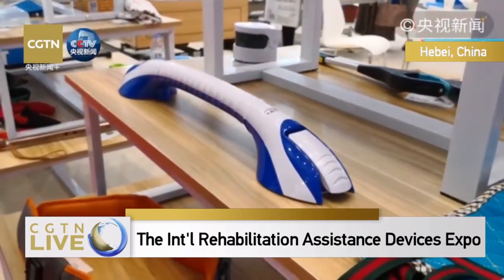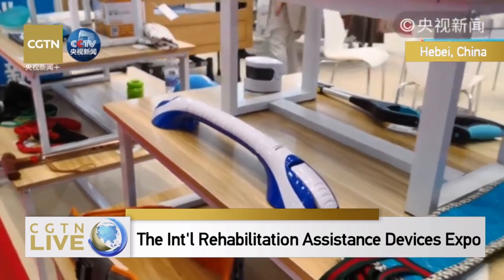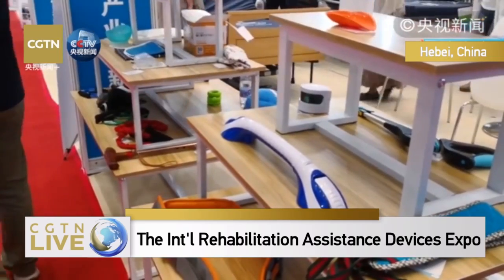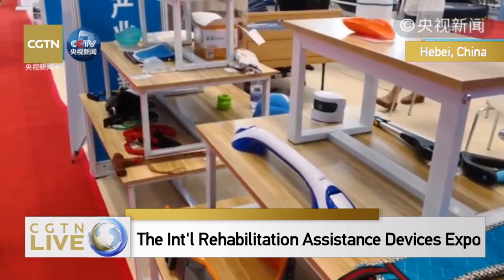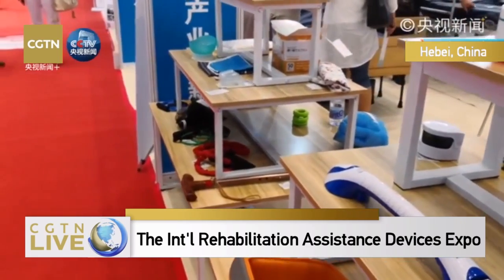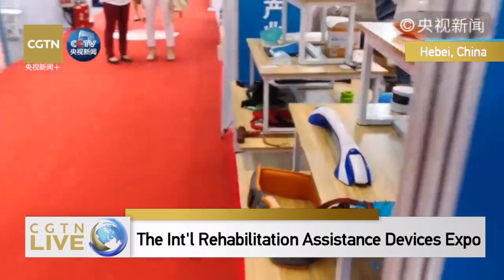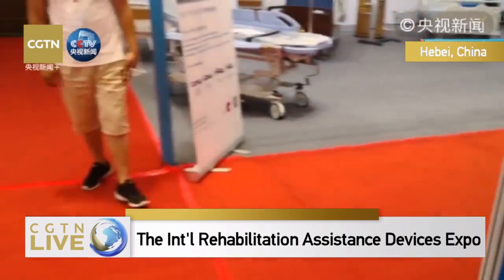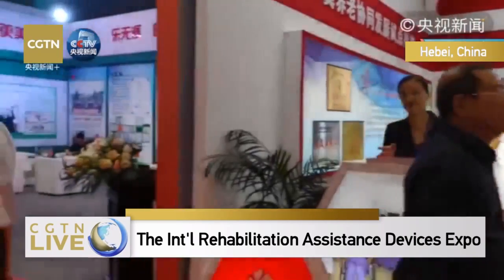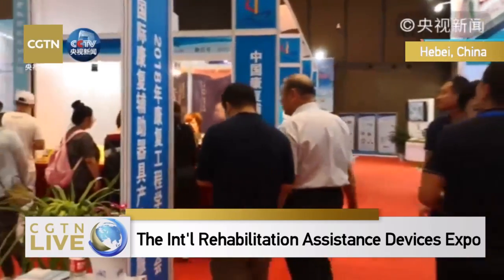And this sucking stick is very strong, and can be steadily attached to furniture. We see a lot of daily used products in this exhibition hall. They can be frequently seen in this exhibition hall.